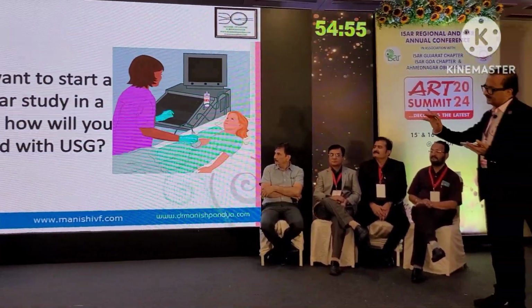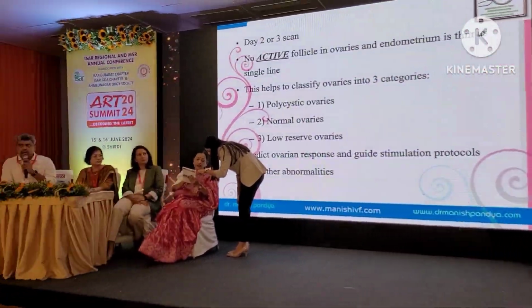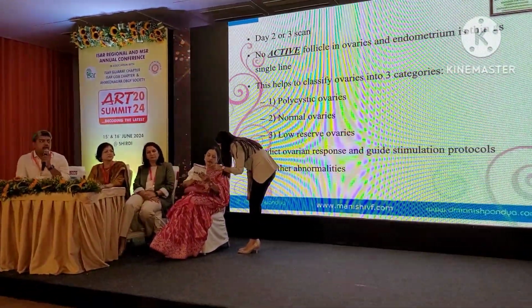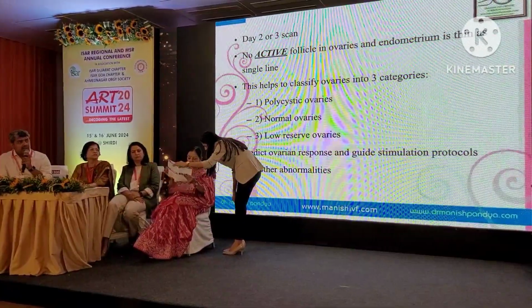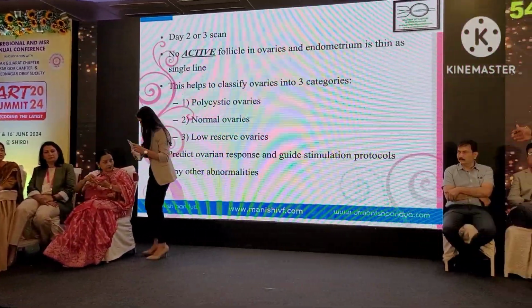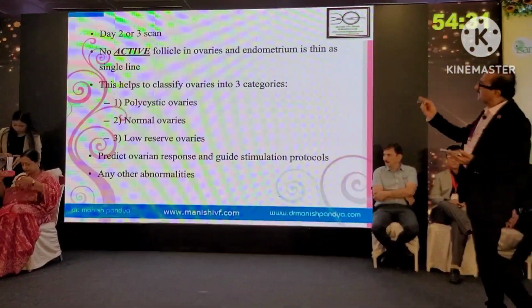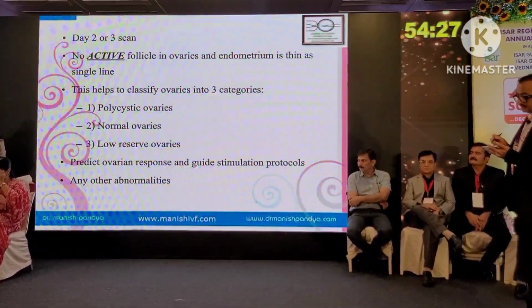First is follicular study, because everyone wants a very good follicle. Yes, starting on day 2 or just to evaluate the patient from the beginning. On day 2 scan, whatever management we are doing depends on that. Whether you are going for IUI, planned induction cycles, or if you want to do ovulation monitoring, basic evaluation of the patient starts with transvaginal sonography.